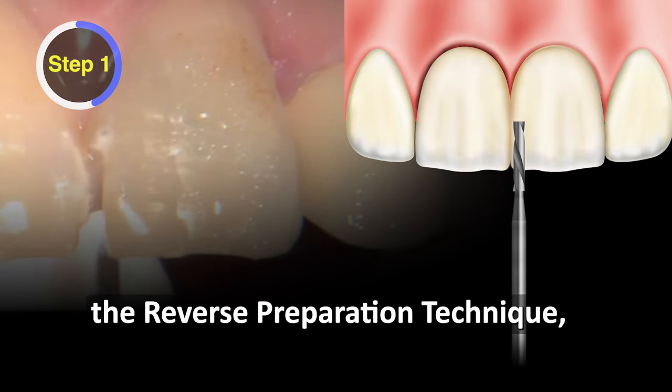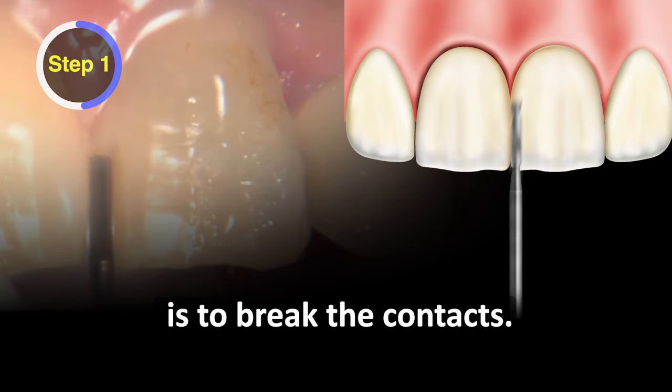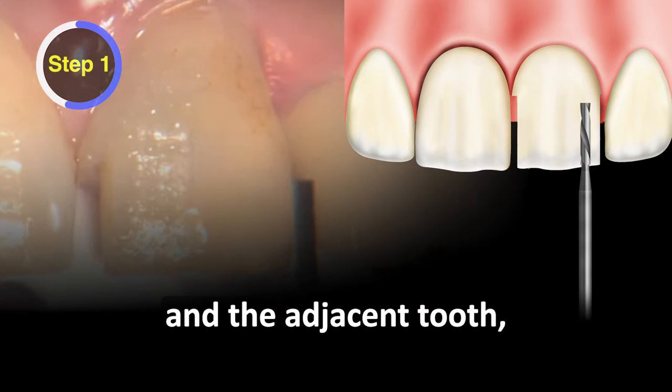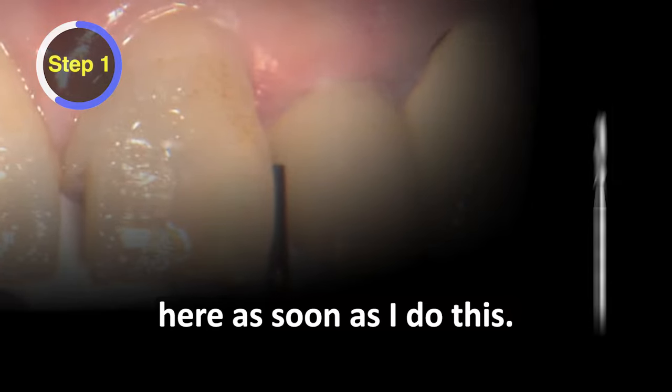Step one of the reverse preparation technique, like most other crown prep techniques, is to break the contacts. I'm just gonna use a 56 burr here. All we're trying to do is create some space between the prep tooth and the adjacent tooth, because I'm gonna slip a little retraction cord in here as soon as I do this.